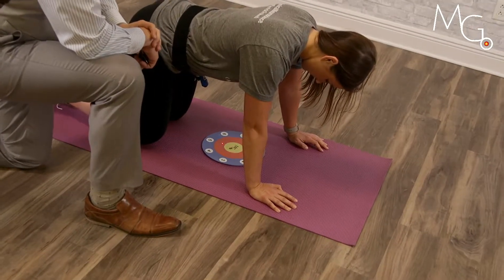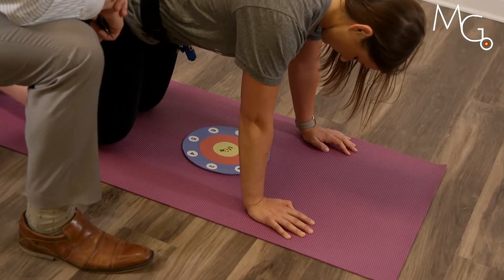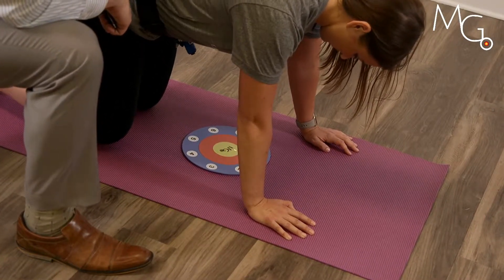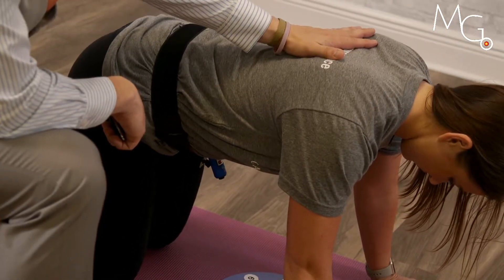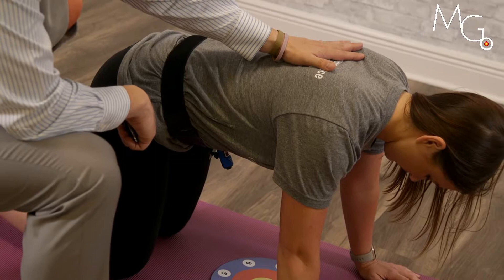Recreating that motion up and down. The clinician can assess unwanted motion from the thoracic spine and cue the patient to not move below their hand and just move lower.